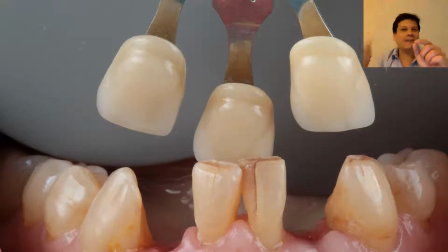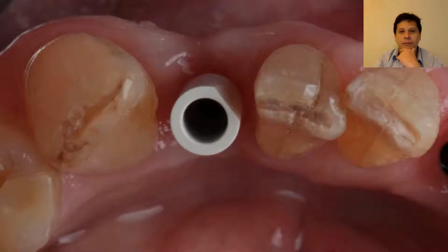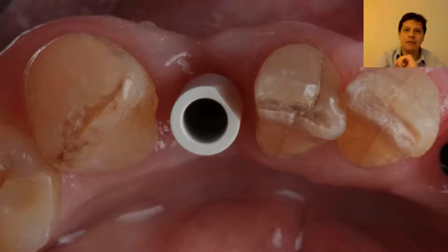So what you're going to do now is restorative dentistry. You are going to complete the cycle. You're going fully digital again. So in this type of situation, you have two steps where you want to go. First, you do the scan body impression, and then you send it directly to a monolithic zirconia that you have from a block. You have a tooth and it's ready to go.